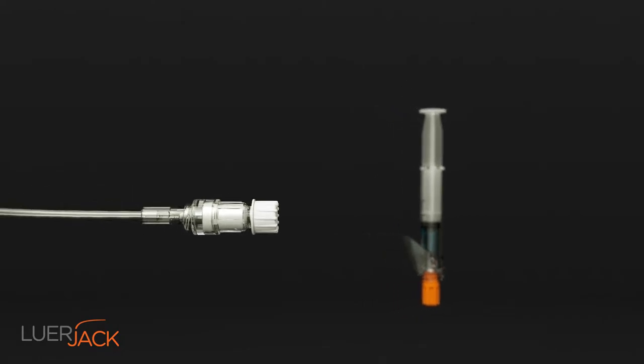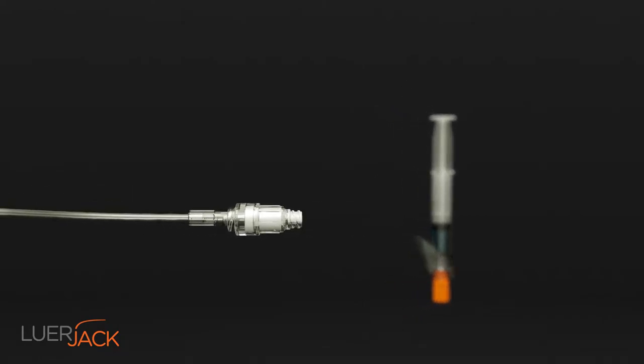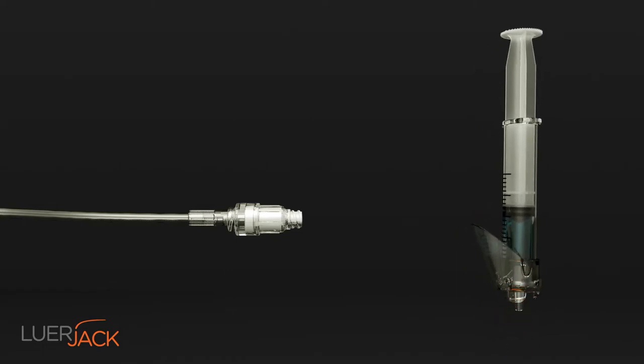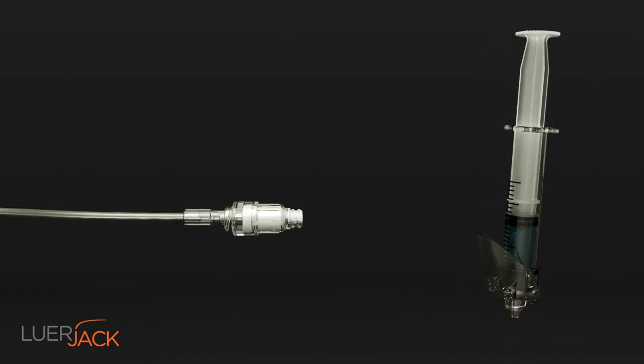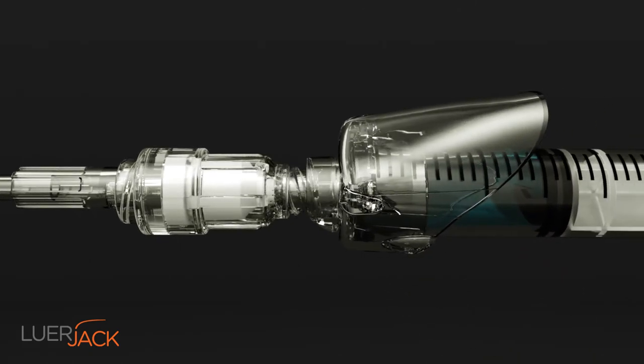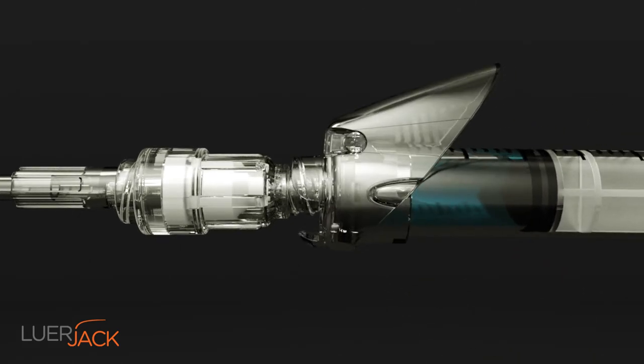By using Luerjack, the risk of contamination and human failure are reduced significantly — up to 50%. Twist the Luerjack lock up to 90 degrees and the syringe is properly connected and ready for use.